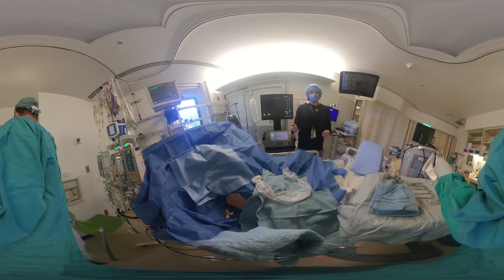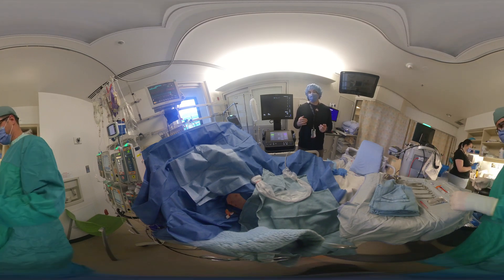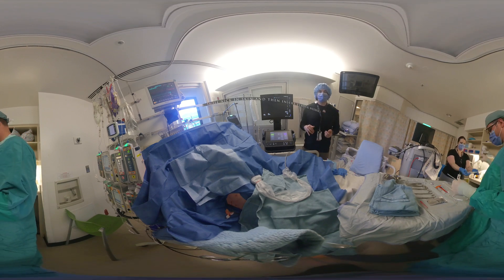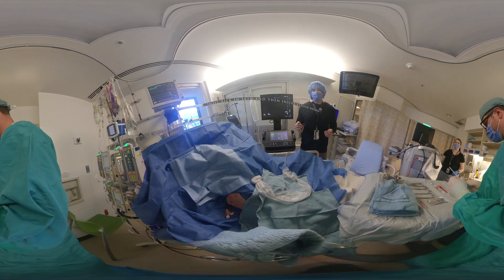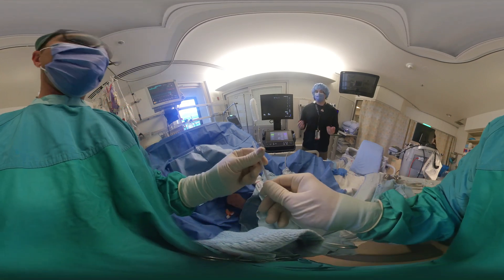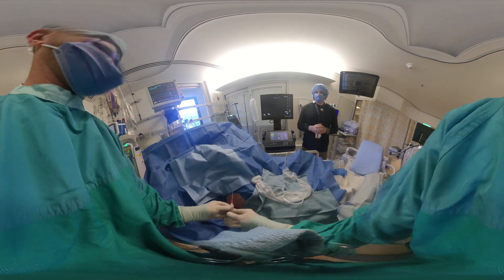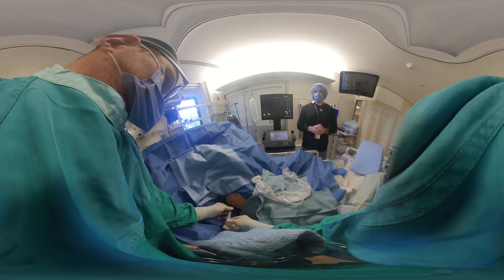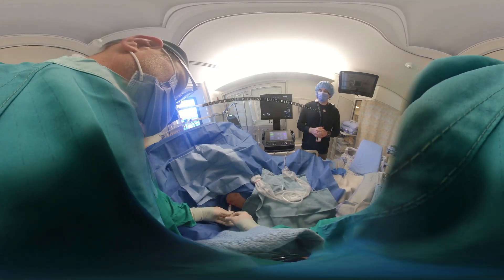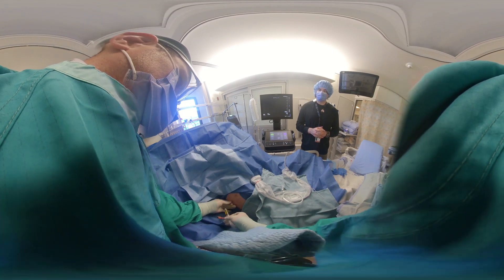The finder needle itself will pass to the rib and you'll go over the rib slowly, aspirating as you pass. Once you've successfully aspirated pleural fluid, you can then pass the wire and follow the steps accordingly. We'll pass the finder needle right into the pleural space, slowly over the rib, aspirating as we go — that's successful. Leave it in place and now pass the wire, making sure to control the wire at all times.